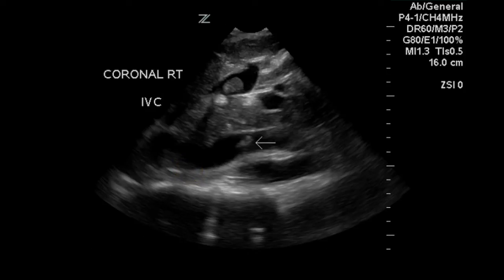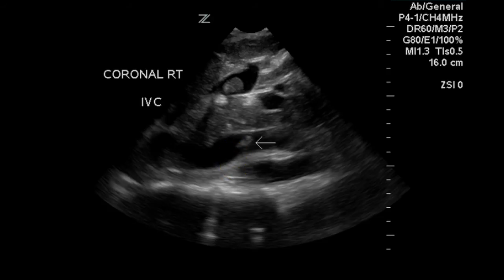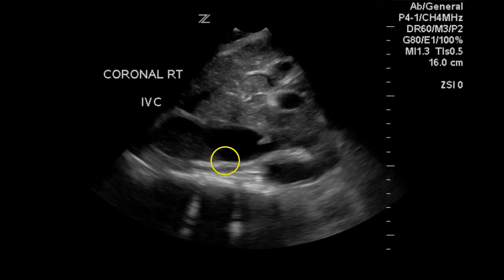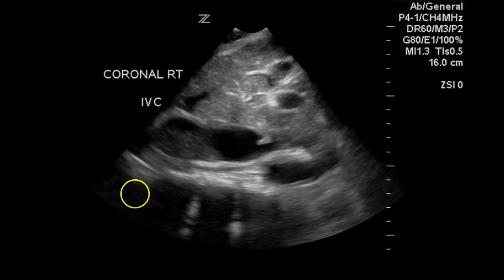This is an image of the vena cava — a coronal image from the right side. We can see some thrombus superiorly and significant thrombus in this location. Again, thrombus in the vena cava, which is somewhat enlarged, and with some increase in gain it shows up very nicely.